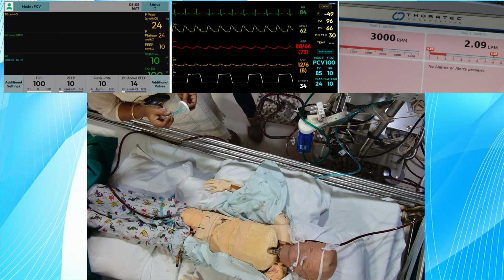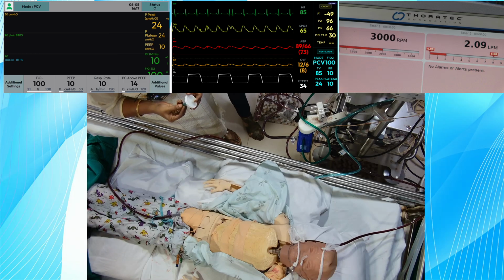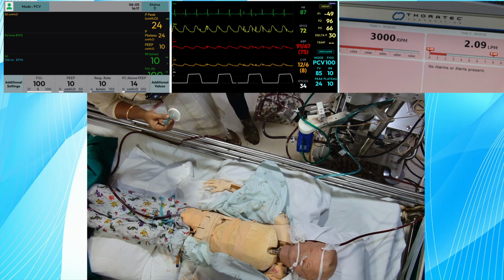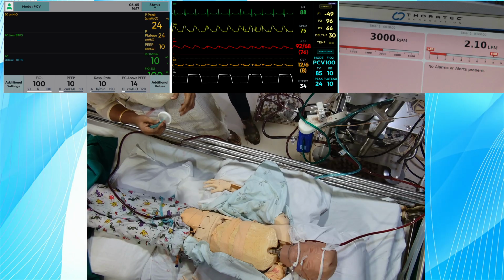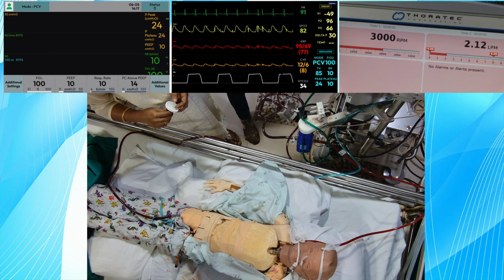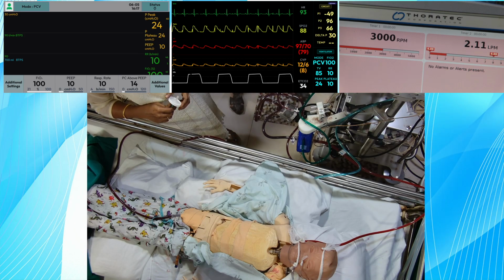So what is the problem? There must be a leak in the sweep gas port. On the patient ventilator, okay, if suddenly your tidal volume comes down, what do you do? Disconnection. Leak. Other possibility? Displacement, obstruction, pneumothorax.